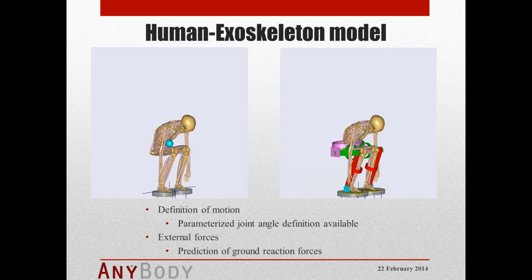So let's go on for now. So what have we done then as a motion? In our case, we wanted to see a sit to stand motion, and here I have two animations. The motion was exactly the same for both cases, and in both cases we predicted the ground reaction forces ourselves.